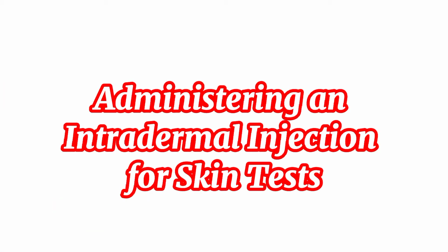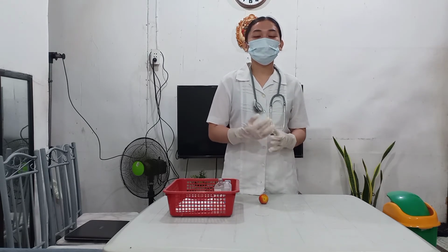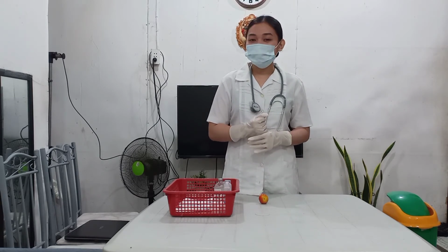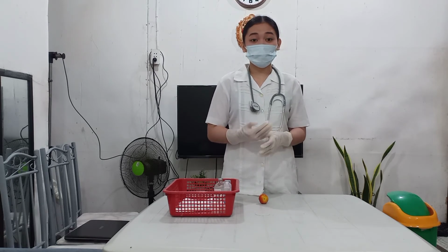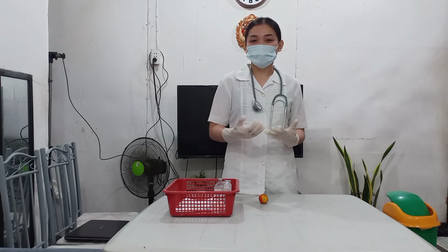Now, I will proceed with administering intradermal injection for skin test. The first step is to perform hand hygiene and observe the appropriate infection control procedures. This is to prevent contamination and possible transmission of microorganisms.